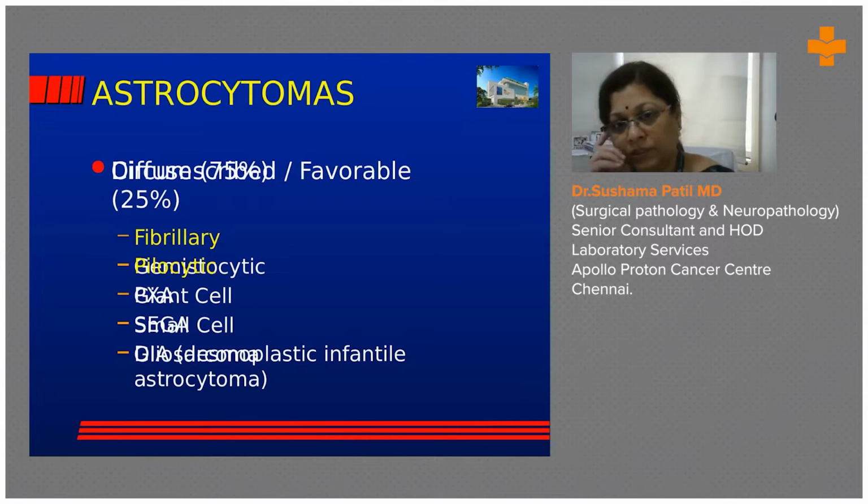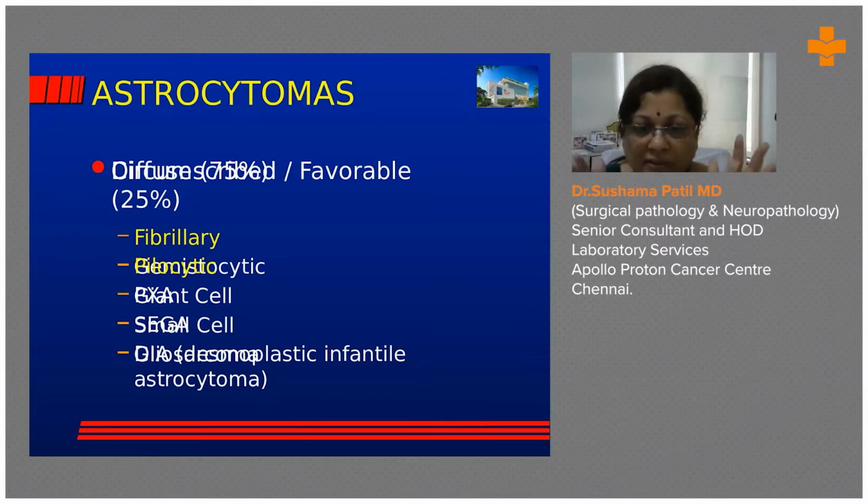So next, with this in the background, I thought I will introduce you all to the astrocytoma. So all this is required. Until now, you have not come to the microscope, you have not even seen the histopathology slides. Now you are going to get histopathology slides. Okay, so I start with astrocytomas.